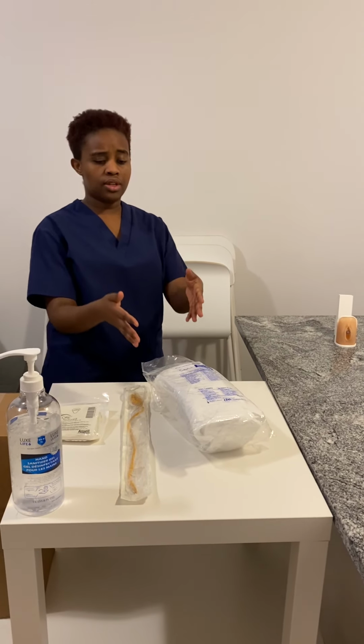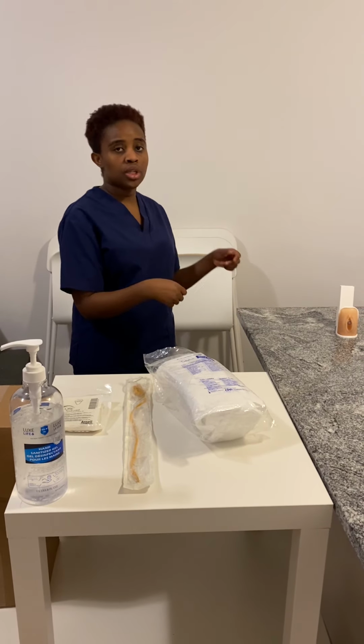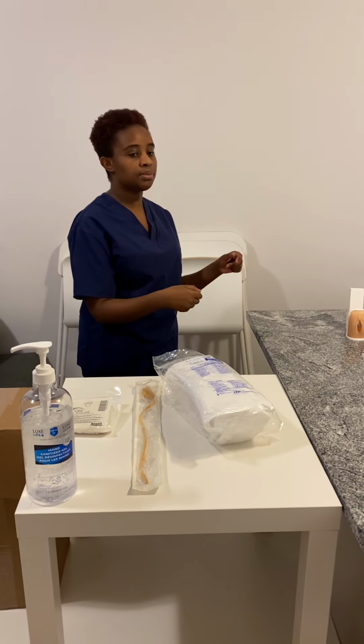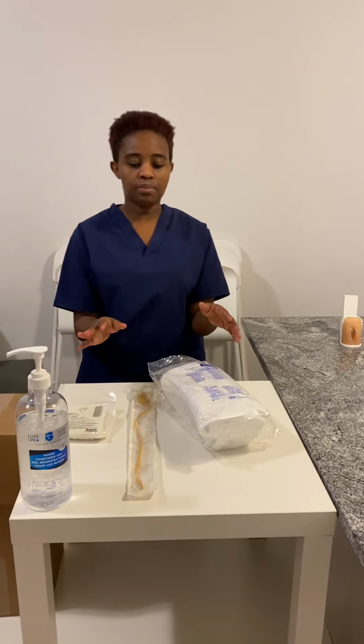sterile gloves. So before I open the tray, I have to make sure that I attach the drainage bag onto the bed, and I have to make sure that the cap is closed. After I've attached the drainage bag, I can go ahead and open the tray. But before touching these equipment, I have to make sure that I sanitize my hands.